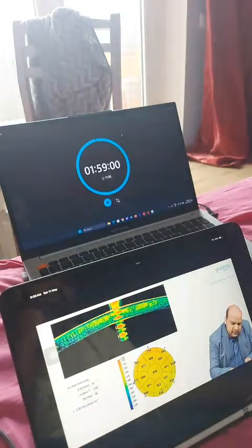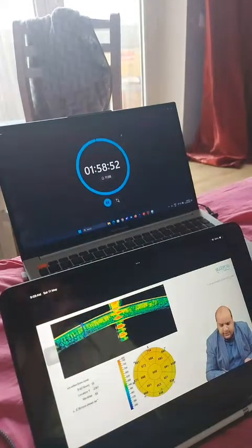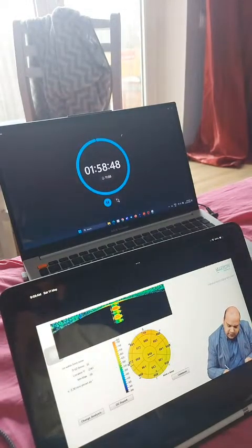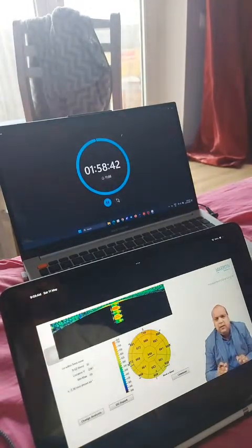If you see carefully, this is my cornea, everybody here. This is my cornea, like this. Now, this is what we are measuring, the thickness from the epithelium to the endothelium. We get a map here. You will be able to see in the center it is 666. As we go to the periphery, in this case, it is increasing to 673 here, 638 here, and various others. Okay, so we get a lot of data based on the various values.